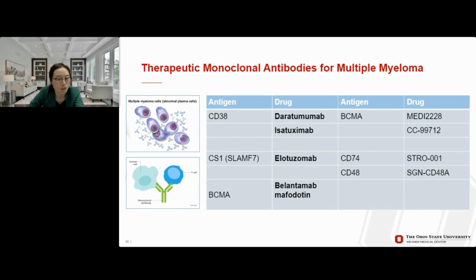The other limitation of gel or capillary electrophoresis is the interference of therapeutic monoclonal antibodies. With the recent remarkable and ongoing development of novel monoclonal antibodies for treating plasma cell disorders, such as multiple myeloma, there are several drugs with the ability to interfere with routine SPEP and IFE or IT analysis.